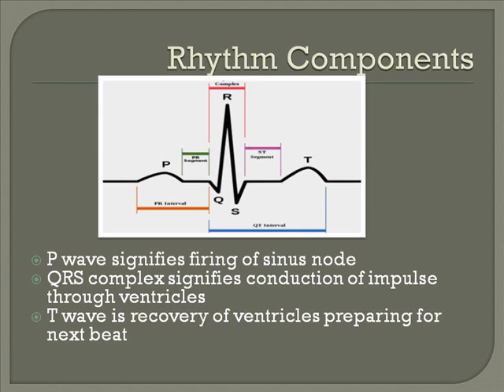It's normally less than 0.1 seconds. The time it takes from the Q wave until the end of the T wave can be important when determining a 12-lead EKG, but we're not going to go into that in this lesson.